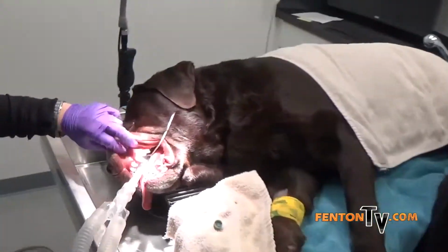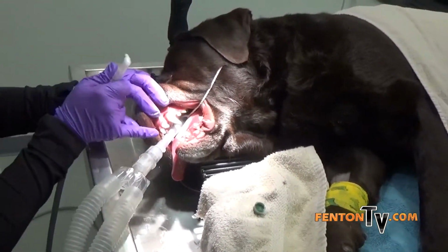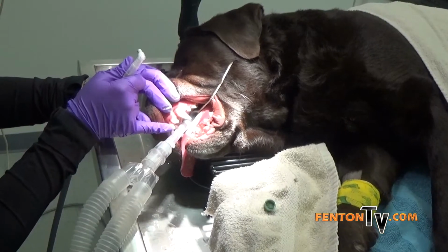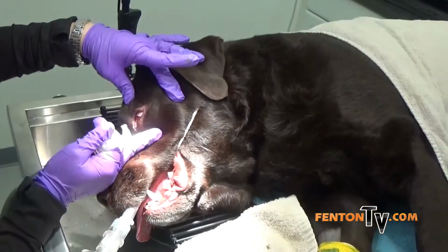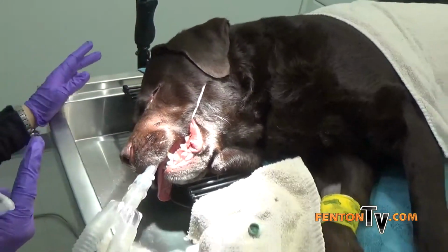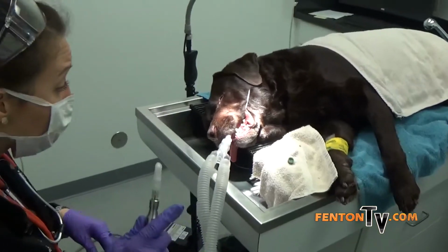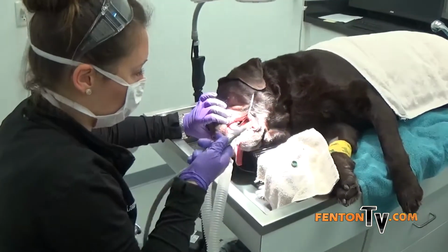Which means he has good oxygen, good blood flow. I can see him breathing through his tube, so I'm watching that the whole time. Also, one thing is position of their eyes. They should be looking at their nose, which he is, and that means that they're in an appropriate level of anesthesia. So that's what I'm doing as I'm scaling, polishing, doing all that as well.